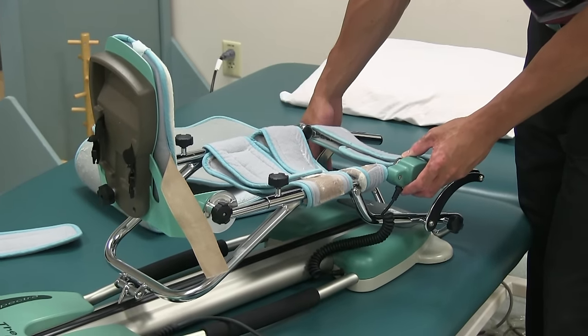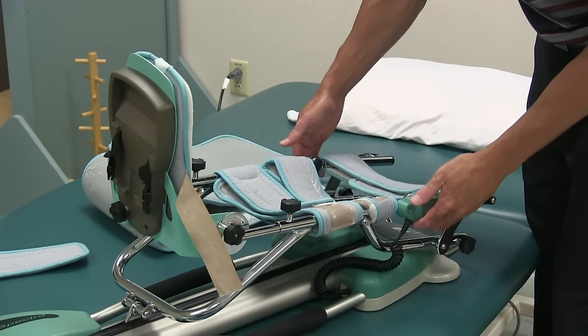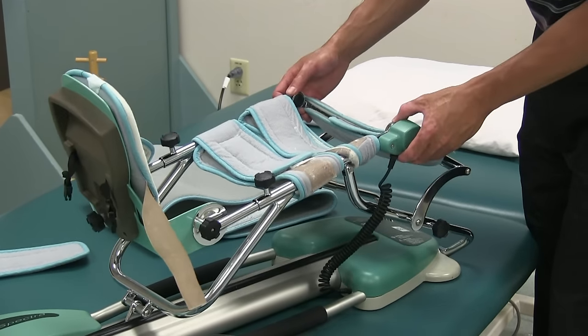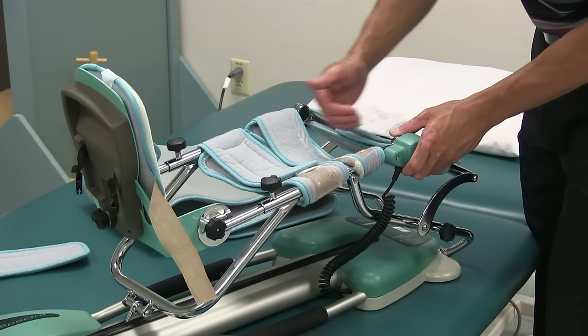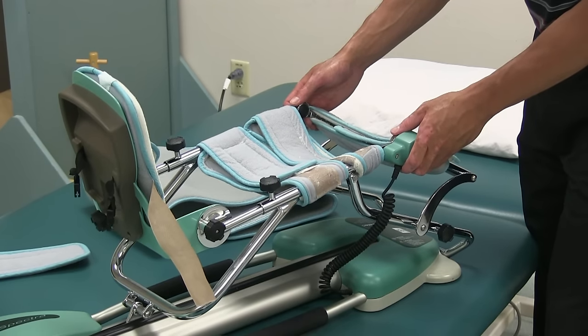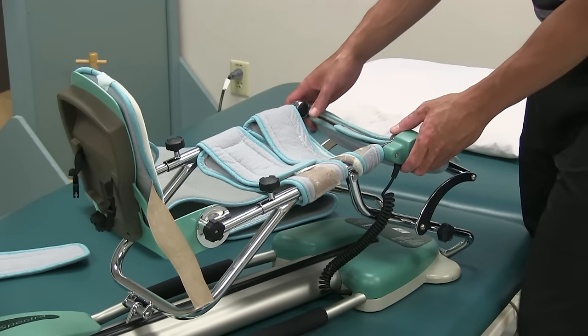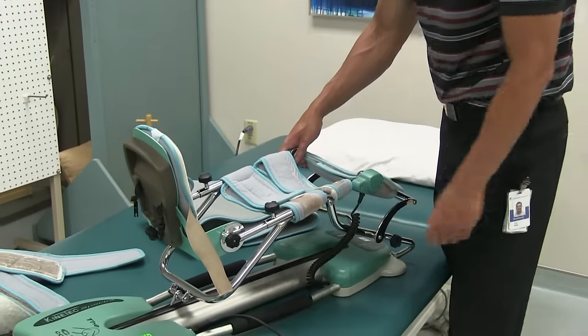When setting up the machine, you want it to be bending and extending at the knee joint itself. If the knee joint is too far up or too low, you'll need to readjust the length. You want to make sure it's in the appropriate spot so that the machine is working as accurately as possible.